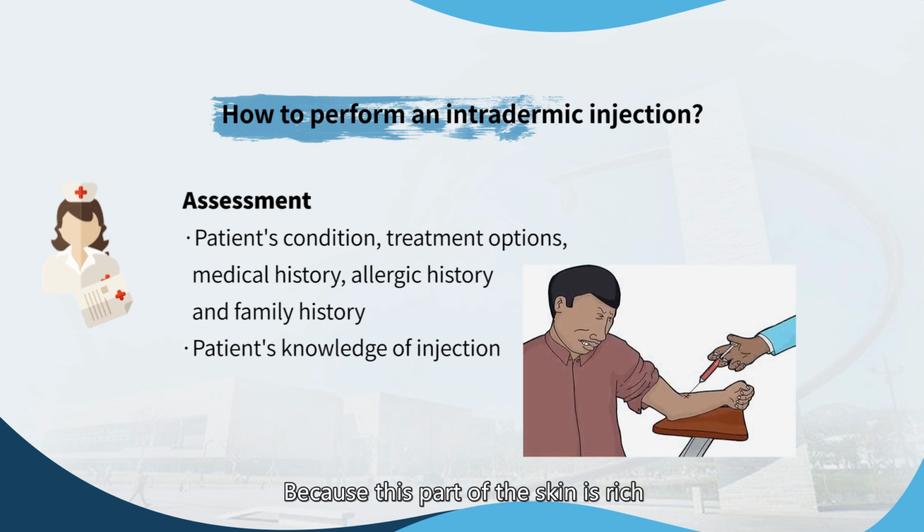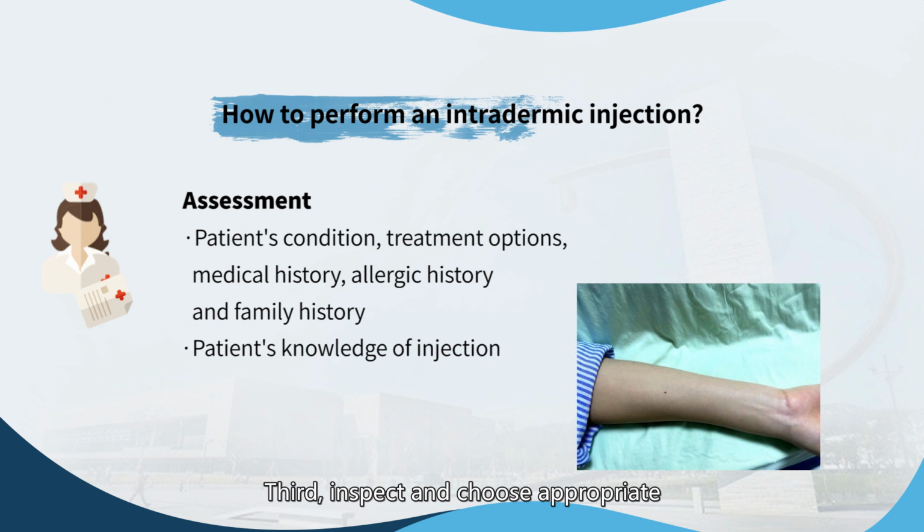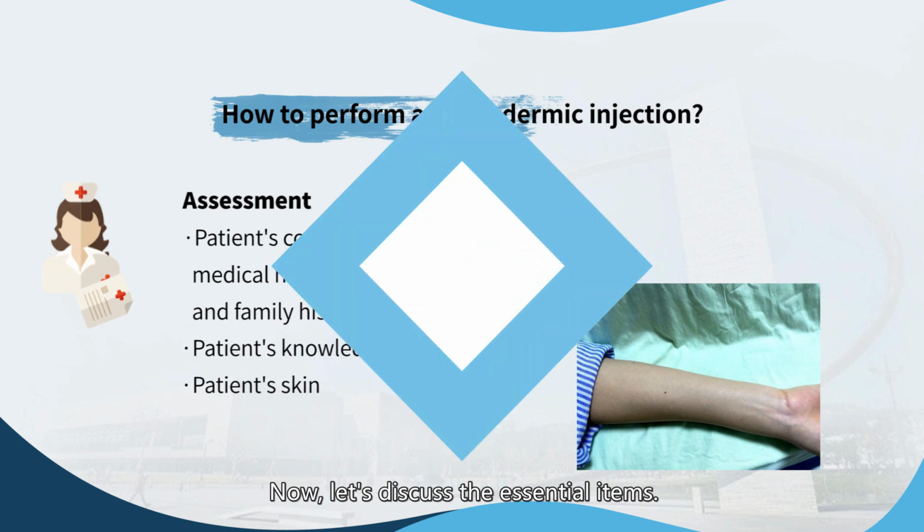Because this part of the skin is rich in sensory receptors and nerve endings, the patient will feel more pain during the intradermal injection. So we will explain this to our patient before starting the procedure. Third, inspect and choose an appropriate injection site that is free from lesions, rashes, scars, or ulcers.